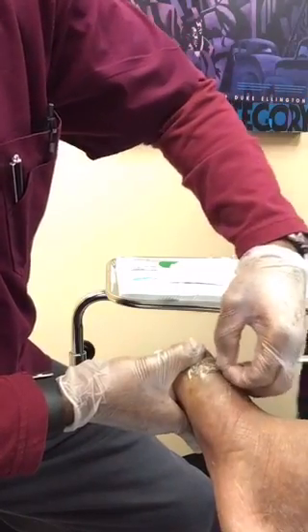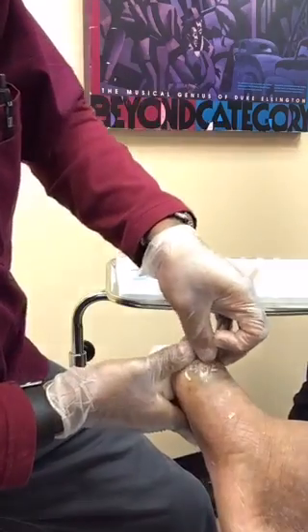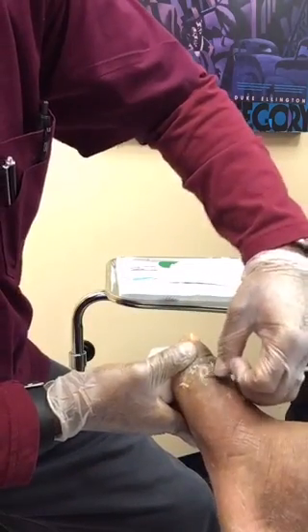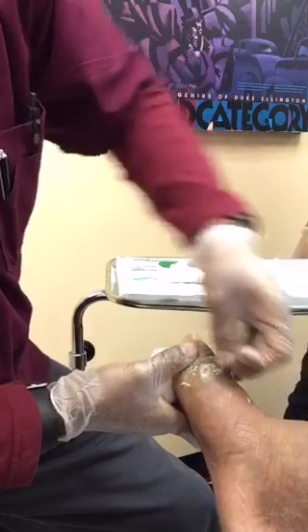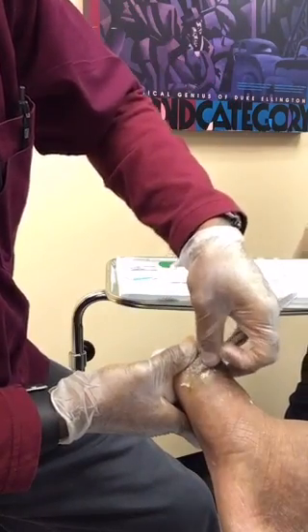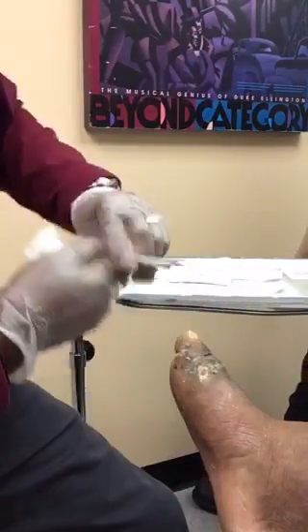As you can see, I'm getting rid of all this callus tissue, this hyperkeratotic skin here. If you don't debride all of these tissues off — all these tissues that get in the way of the healing process — it slows everything down and they will be an impediment to the action of the graft.